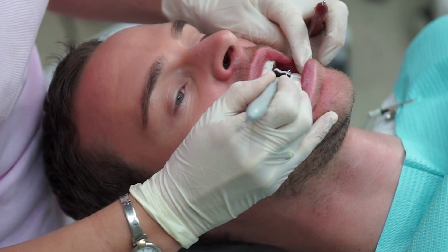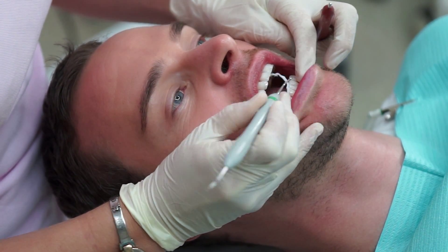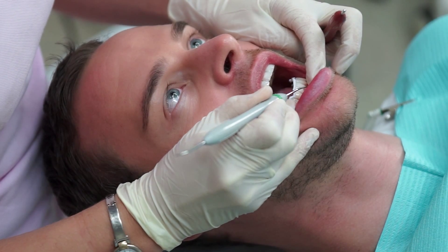Removing the isolating gel is a quite simple procedure done with a curette.